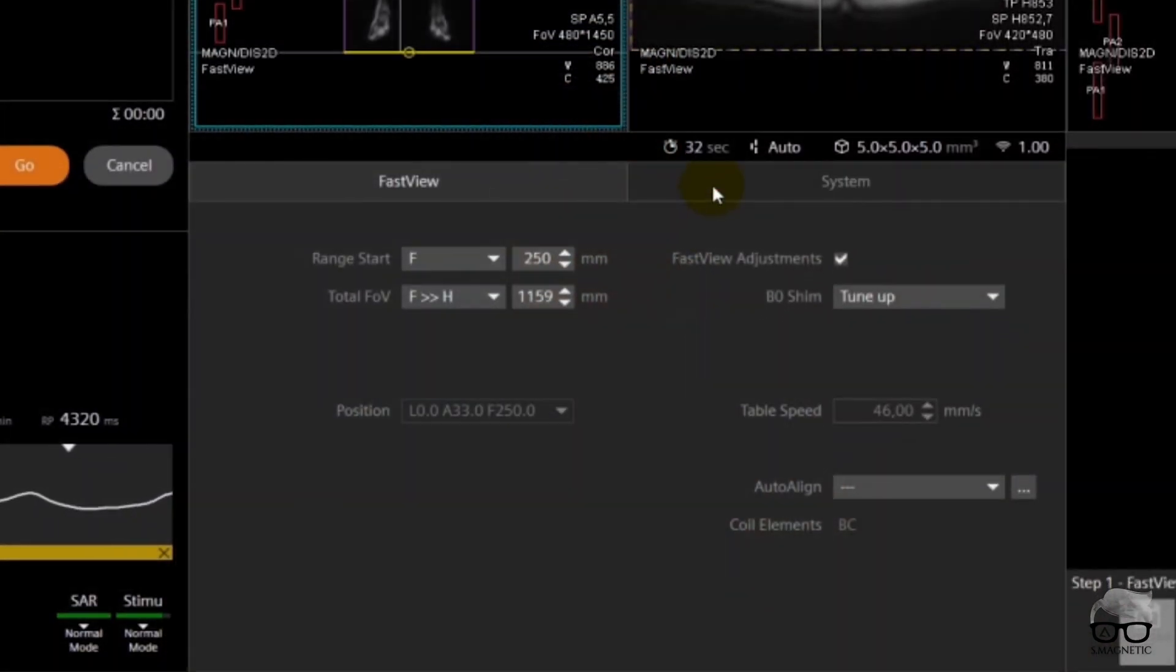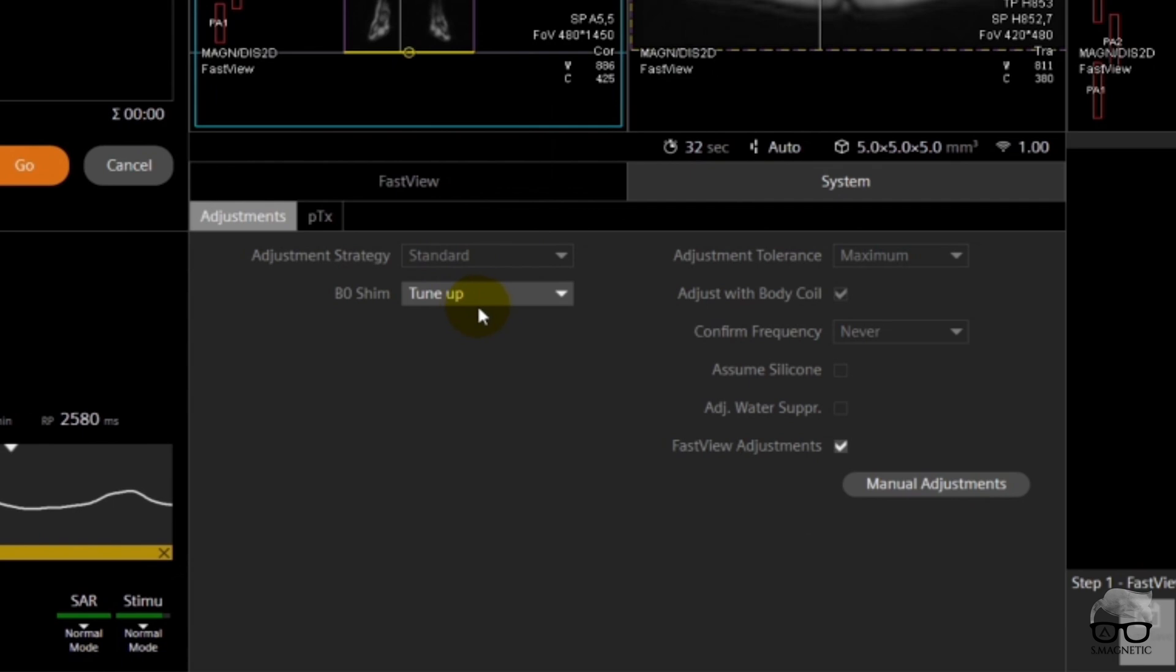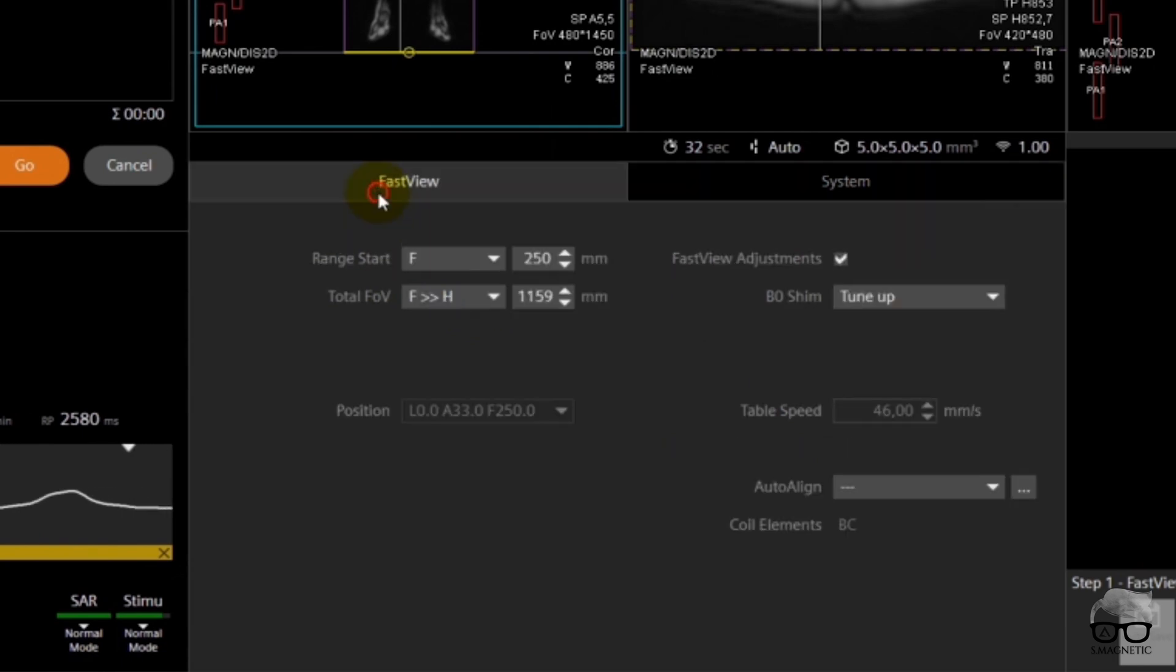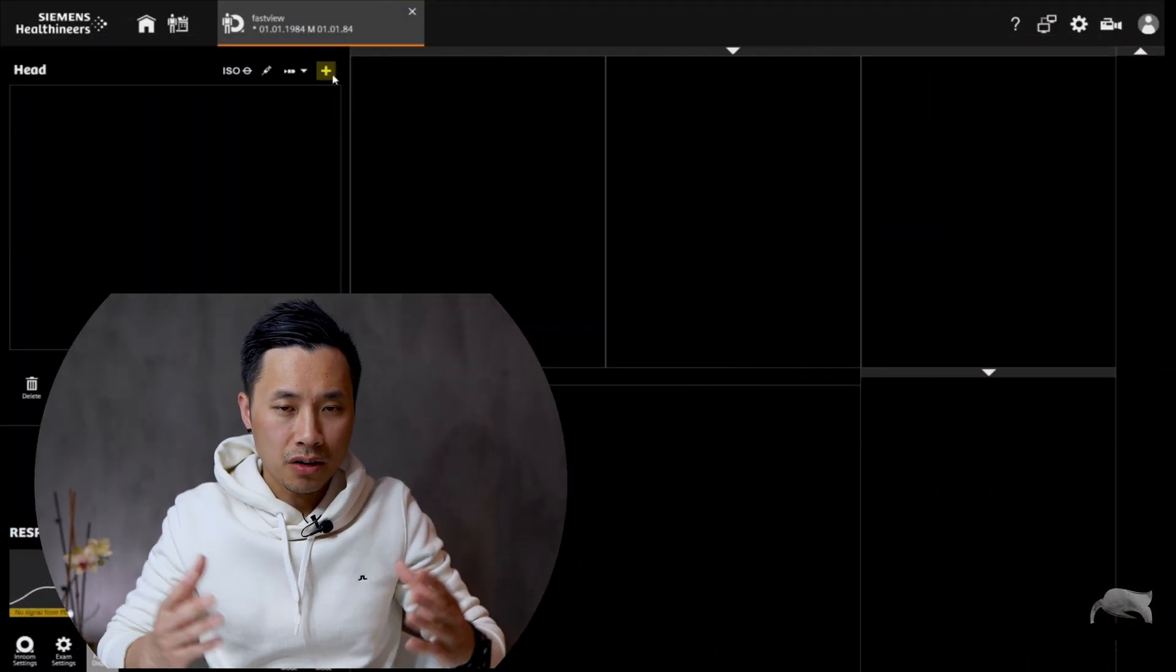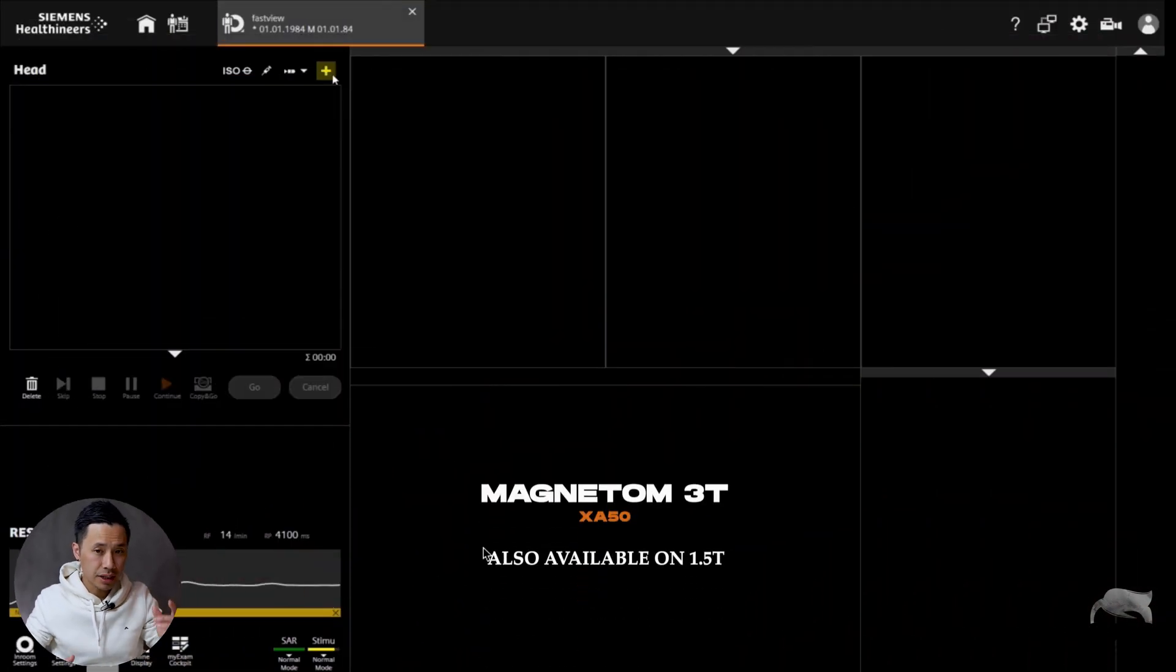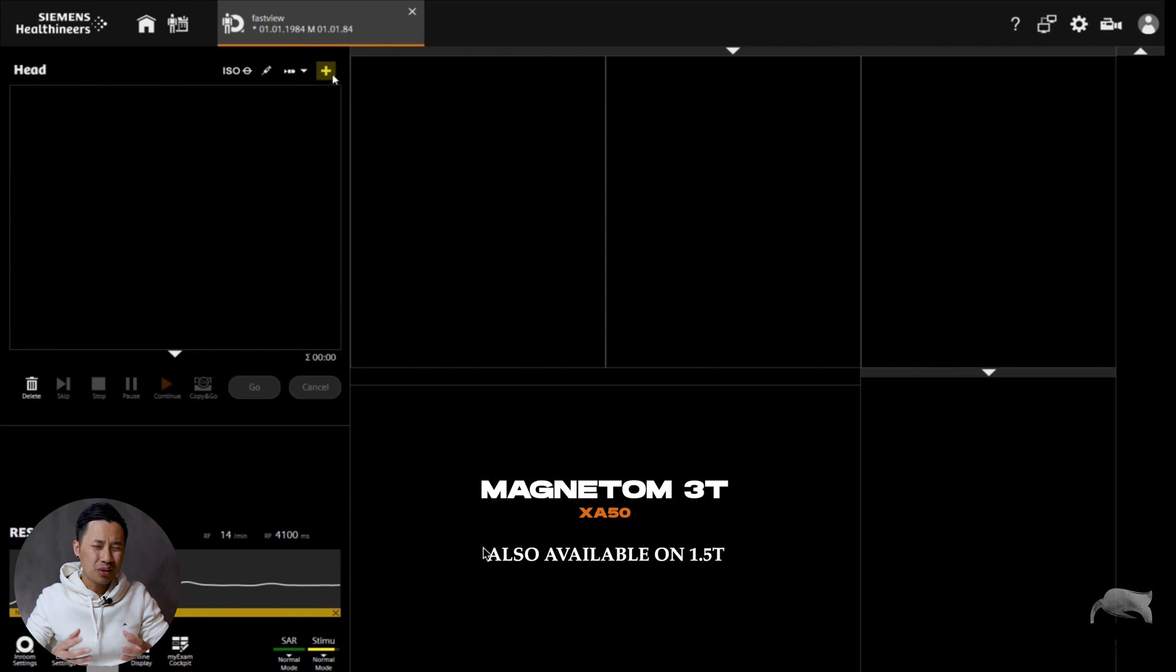With the Fast View localizer, you get an overview of the whole body of interest, so it's easy to use if you know how to use it. That's why I wanted to make this video, to show you a few tips and tricks. So without further ado, let's go to the scanner.